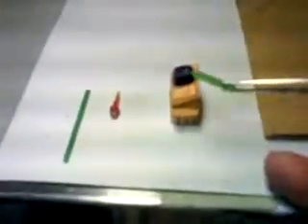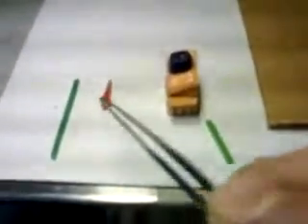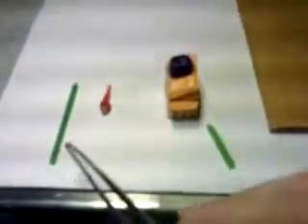Okay, things keep going. At this point, before spruing, I will be choosing the section of my spruing channel, and this is a 3mm, because I will have much more metal to fill up the casting of this post core compared to this other post core. So I will need for my metal to have a larger channel to flow through compared to this 2.5mm square section rod. It's a square section which will be used for the post core that our dentist achieved in the patient's mouth.